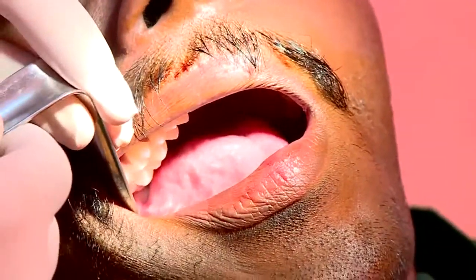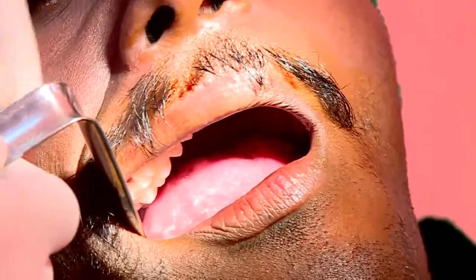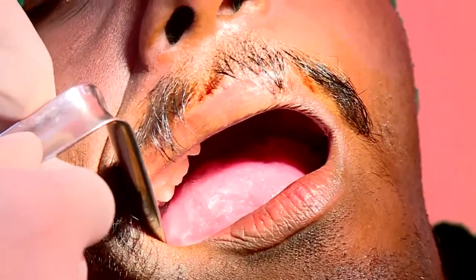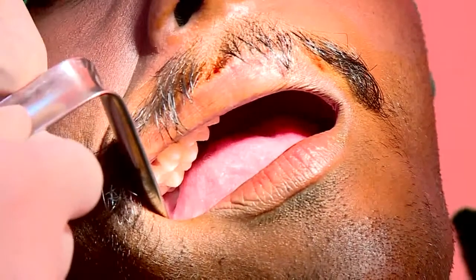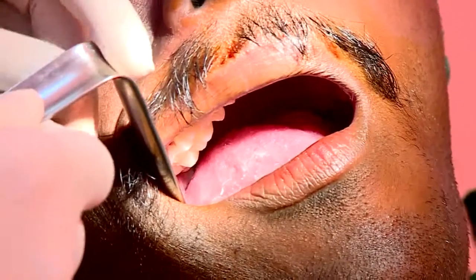You can see this. This is a horizontal type as discussed. You can see a partial crown here. This is horizontal. The distal part of the crown is clearly visible. Okay. Little more focus.